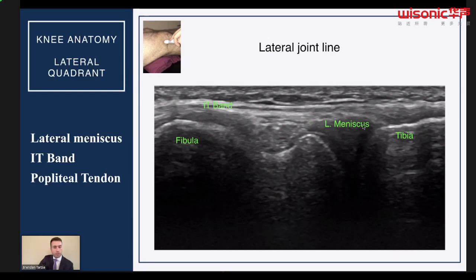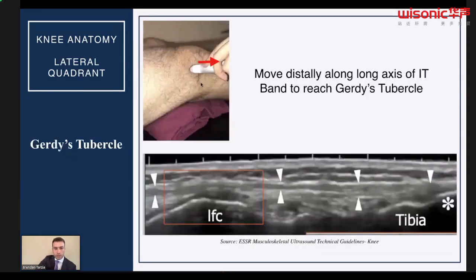You can take a look at the meniscus. You can see if there's any irregularities in that meniscus. It should all look generally the same distribution when you take a look at all these structures. So if you see any abnormalities, like an area that's more hypoechoic, or you see any irregularity there, then that can possibly be pathology. And so right here, this is going to be the tendon that we're seeing in this area here as well.